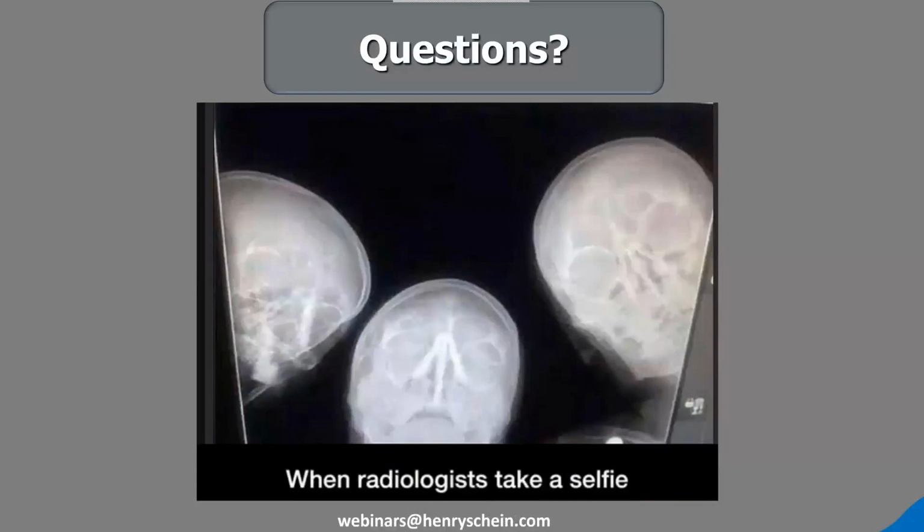The first one is, is 3D more technology than what most general dentists need or encounter on a daily basis? I would say the 3D technology is exactly what a dentist needs and encounters on an everyday basis. We see so much more with 3D imaging than we ever saw with 2D imaging. And you'll see that as you start to go through and look at your 3D scans. We're seeing so many more periapical lesions in particular, but we see quite a bit going on even in the sinuses. And so it's great for our patients, especially if we're passionate about being able to help them, and especially if we're passionate about whole patient care.